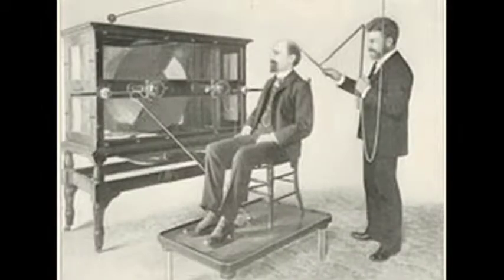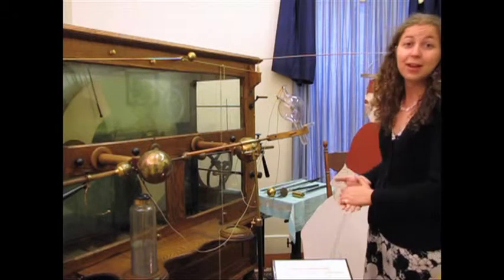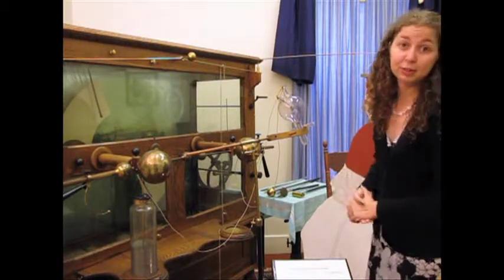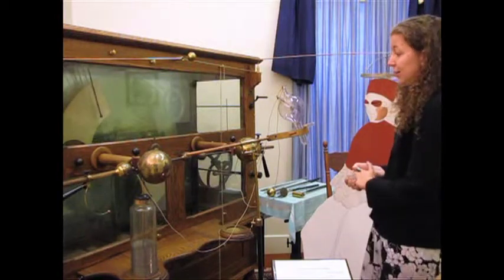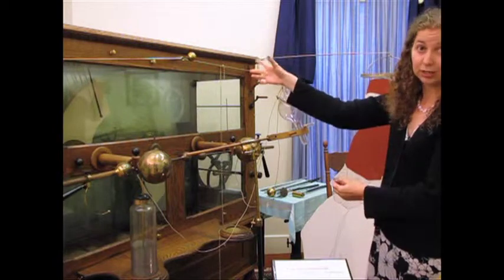So this machine was not only used for x-ray. It was also used for something we call electrotherapy. And electrotherapy was basically just treating medical illness with electricity. We still kind of use that today in physiotherapy. And so basically you could attach a number of different things to the electricity source.